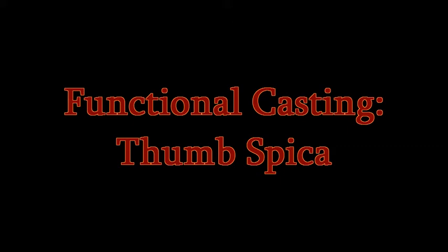This video will show you the materials needed, application, and modification of a functional thumb spica cast. Medical professionals can use this tool to prevent and protect against injuries to an athlete's first MCP joint.